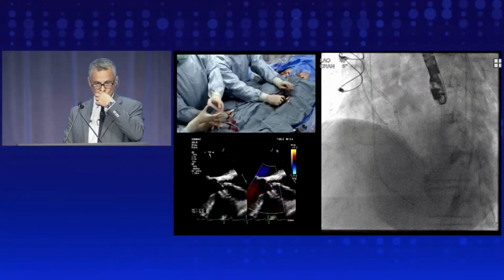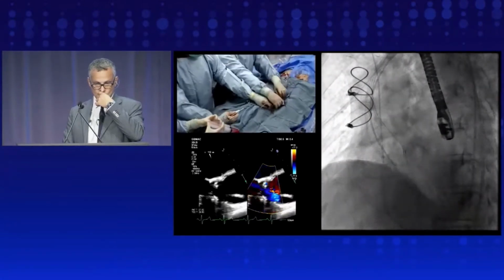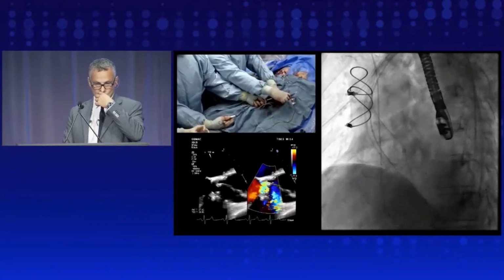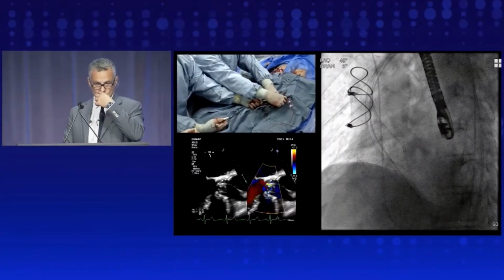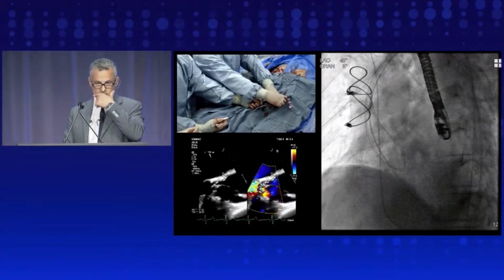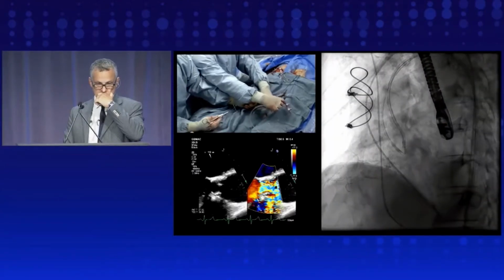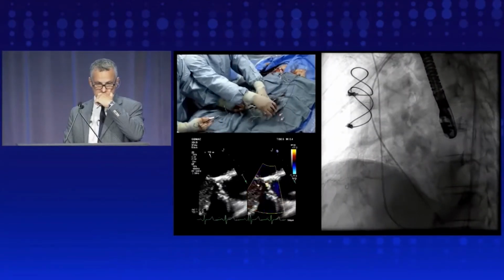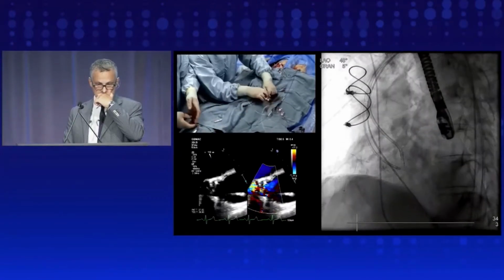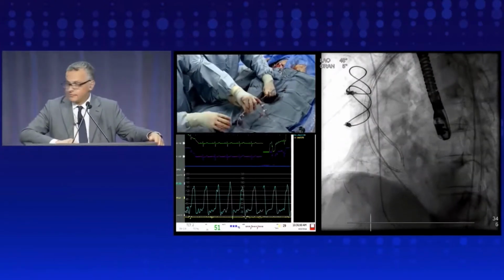Okay. So here we go with the laceration of the left. Go a bit like that. So the pull should not be a strong pull. We want the tear to be a controlled tear. So injecting dextrose. Okay. And you saw at the end the pull. And hemodynamics are still stable.